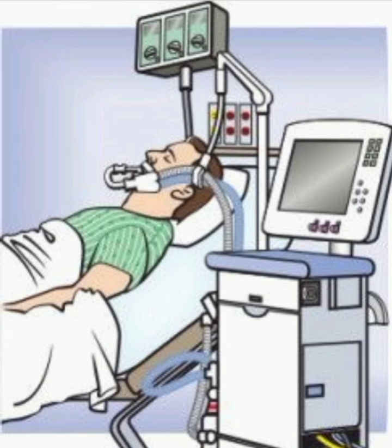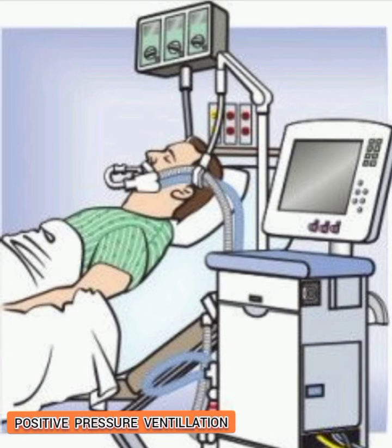Now, I would like to talk about positive pressure ventilation. In the diagram showing positive pressure ventilation, positive pressure ventilation is a form of respiratory therapy that involves the delivery of air or a mixture of oxygen combined with other gases by positive pressure into the lungs. It describes the process of using either a mask or, commonly, a ventilator to deliver breaths and to decrease the work of breathing in a critically ill patient.